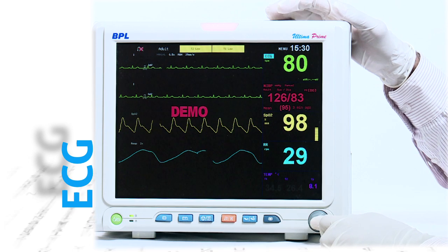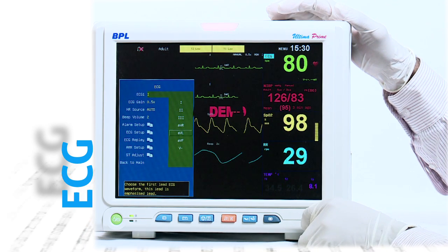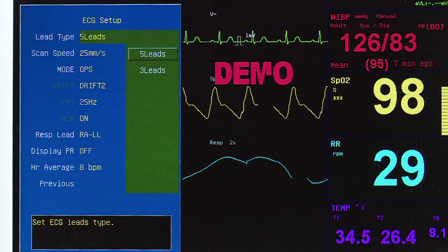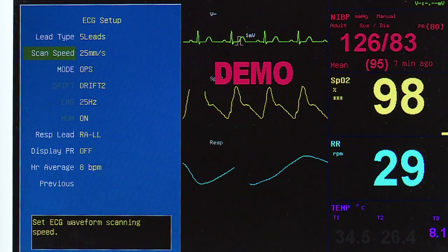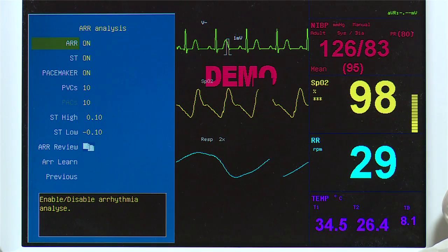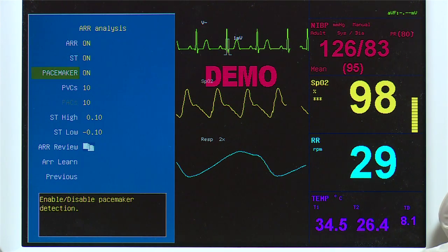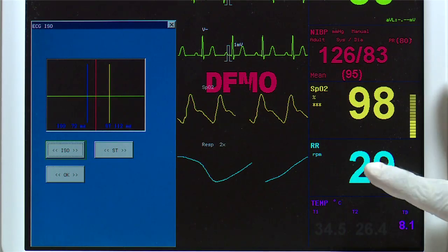ECG is monitored using a 5-lead patient cable with an optional feature of a 3-lead ECG cable. With a 5-lead ECG cable, 7 leads can be monitored, which include Lead I, II, III, AVR, AVL, AVF, and one of the chest leads. Added features of pacemaker detection, ST segment analysis, and arrhythmia detection provide complete information regarding patient ECG.